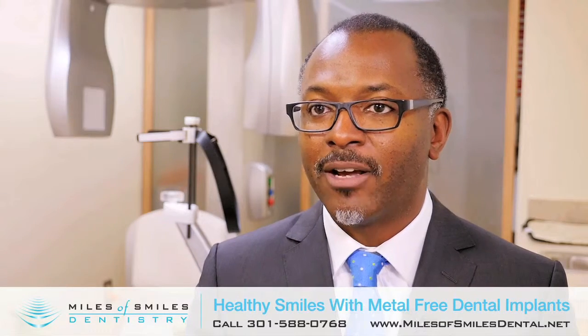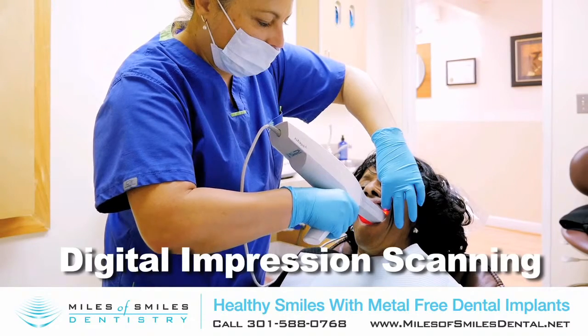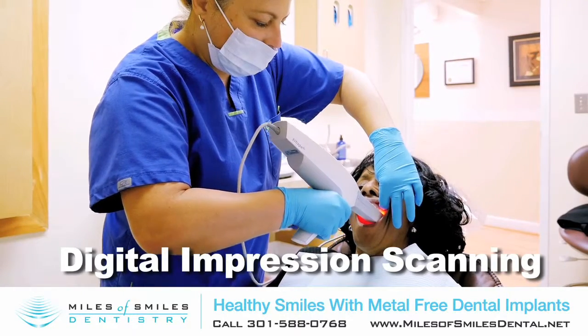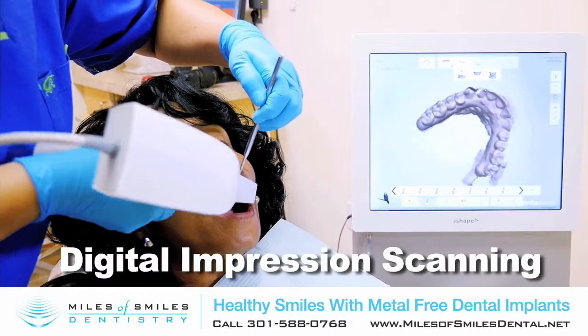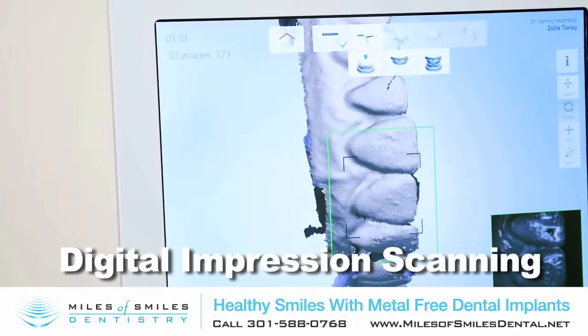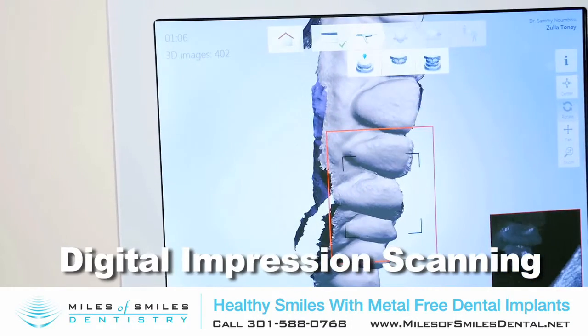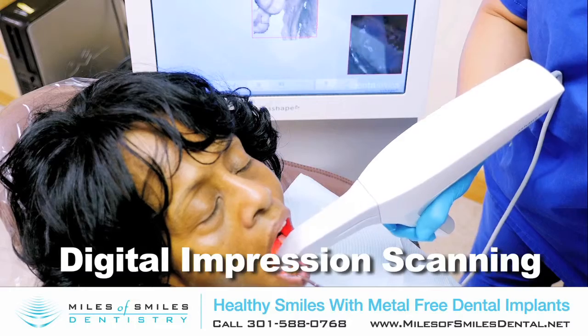What we have done, we have gone into optical scanning. It's a way of taking a picture, making a mold of your mouth without having to put this gooey material in your mouth. And what that does is, not only is it very, very accurate, it also allows us to simulate the treatment that we're doing for you.